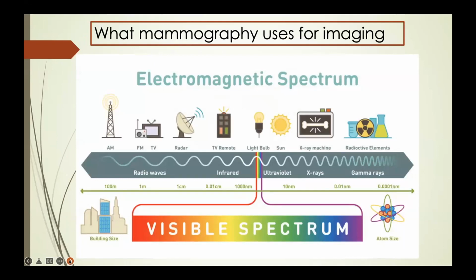I mentioned earlier that it's an X-ray technique. It uses X-rays. And for physics students here, even if you haven't graduated from the university, we all did physics in secondary school if you studied sciences, and you probably have come across this before.